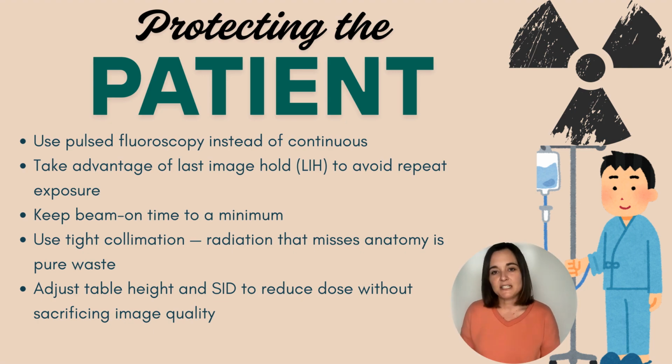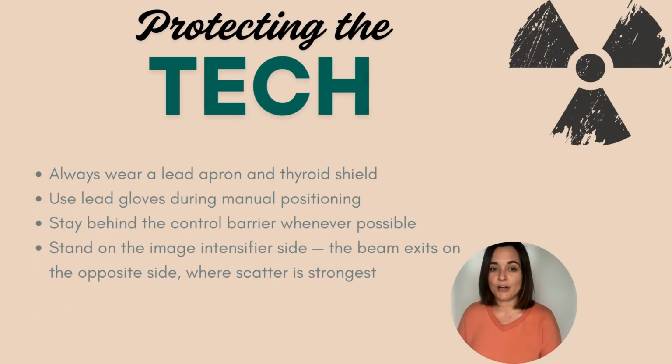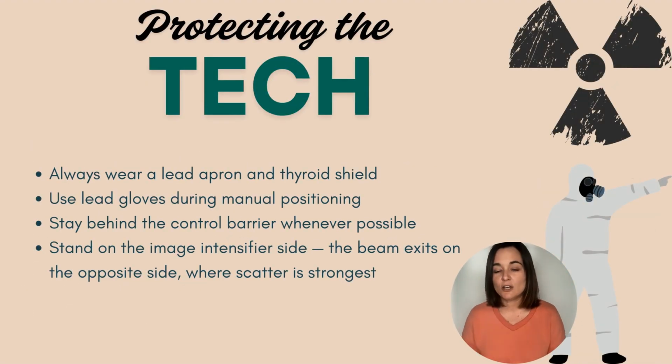Protecting the tech, that's you. Always wear a lead apron and thyroid shield. Use lead gloves during manual positioning. Stay behind the control barrier whenever possible. Stand on the image intensifier side. The beam exits on the opposite side where scatter is strongest.